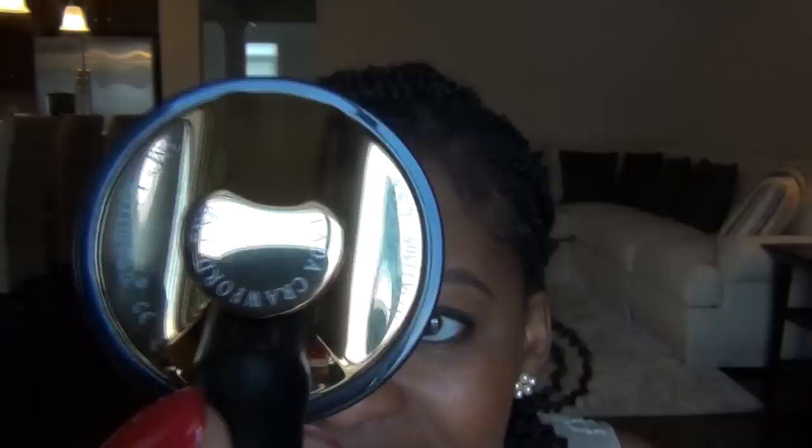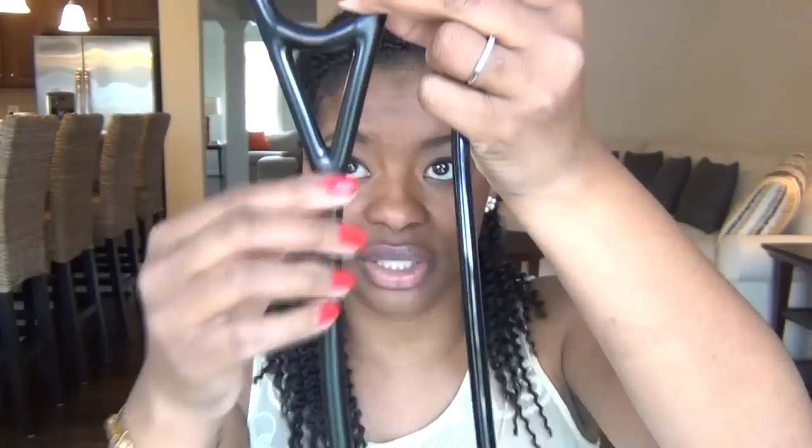This stethoscope is heavy compared to the one I've used for the last few years. My favorite part is the engraving — you can see my name engraved right on there. It fits really well in my ears and the tubing is noticeably thicker; it's made from a different material than the Classic II's more plastic-feeling tubing. This is the 27-inch version.